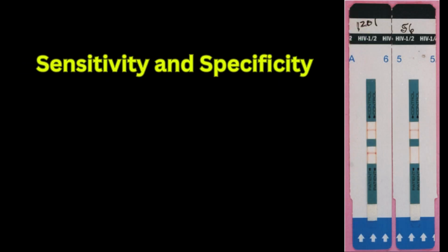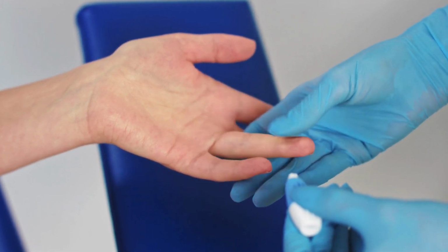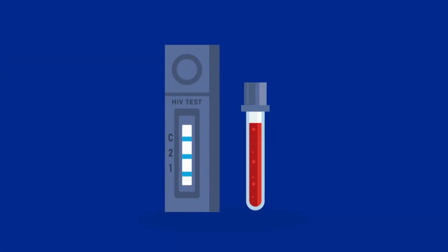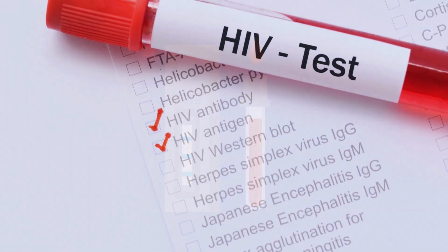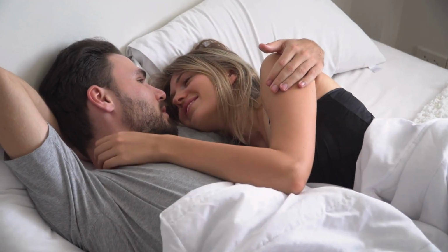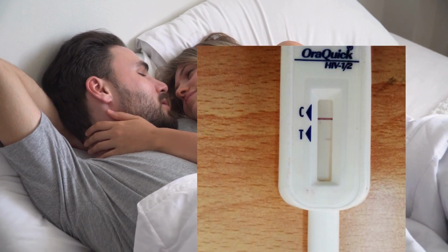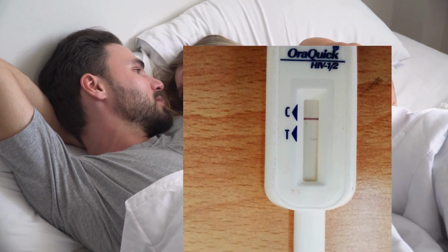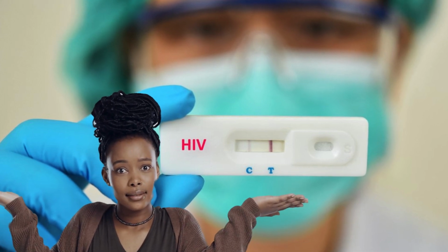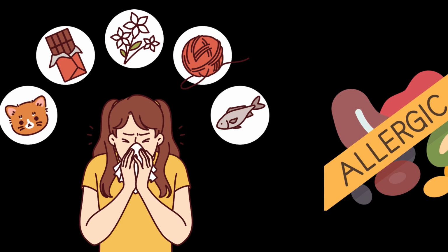Sensitivity and specificity. Modern HIV test strips are highly accurate, with sensitivity and specificity often exceeding 99%. However, they have two limitations. 1. Window period. There's a period, usually 6 weeks, after infection when antibodies may not be detectable, potentially leading to false negative results. 2. Cross-reactivity. In rare cases, other conditions might cause false positive results. For instance, if you have an allergy or any other serious autoimmune disease.